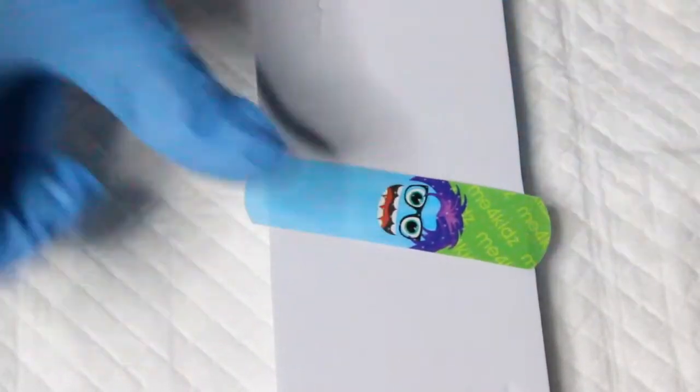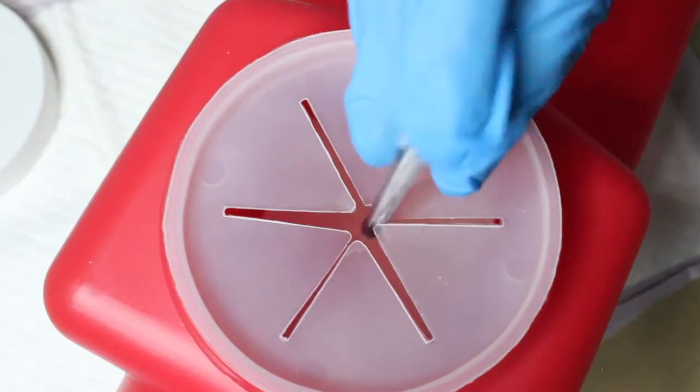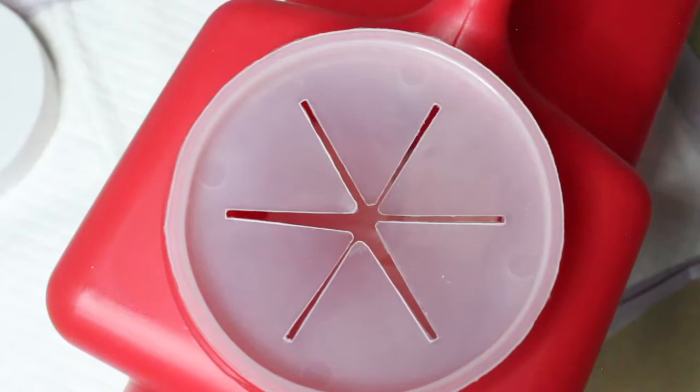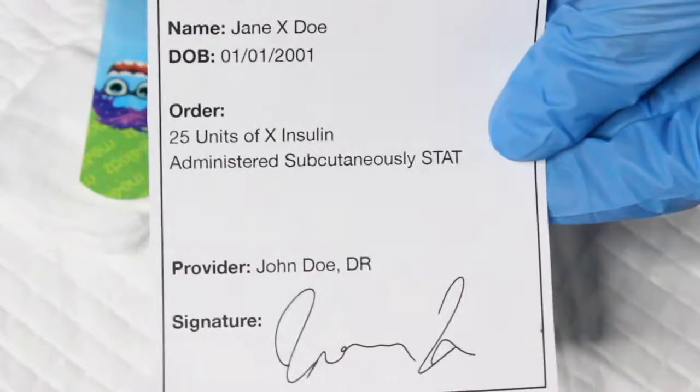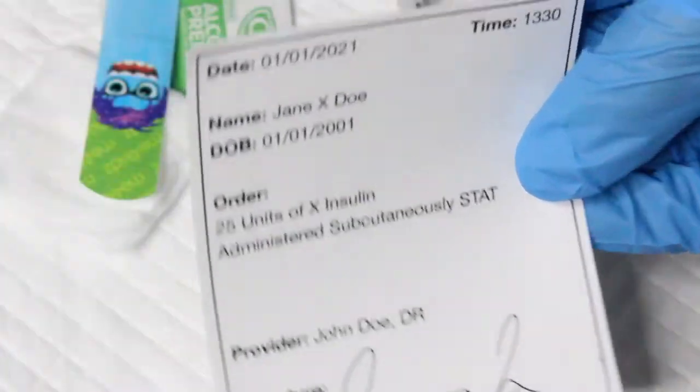Then go ahead and remove the needle and place a band-aid over the injection site if needed. Lastly, clean up by placing the syringe and needle in a red biohazard sharps container and ask the patient if they have any questions. After leaving the patient's room, you should locate a computer where you can document the injection in the patient's medical record.